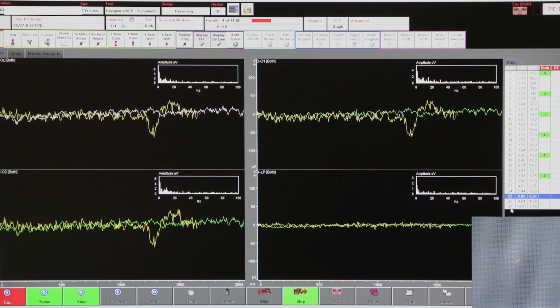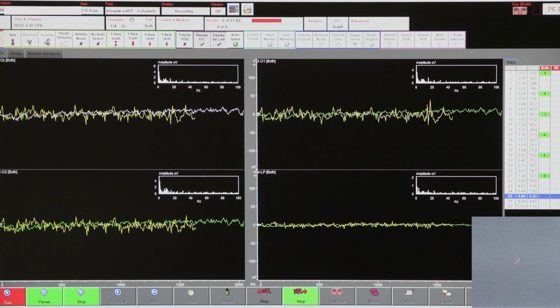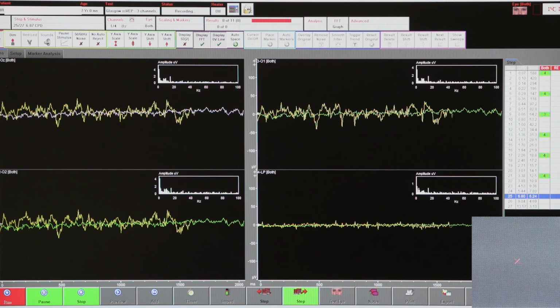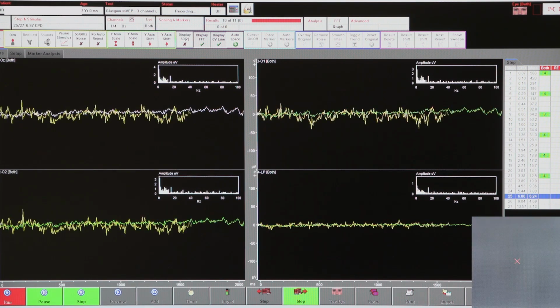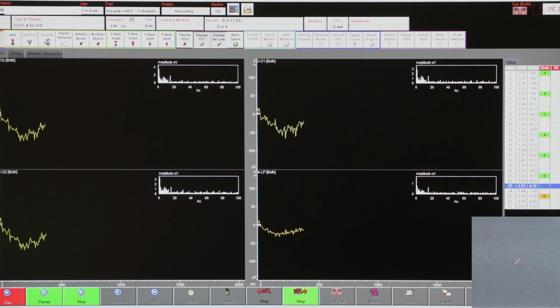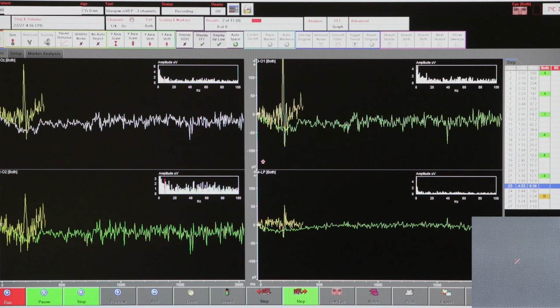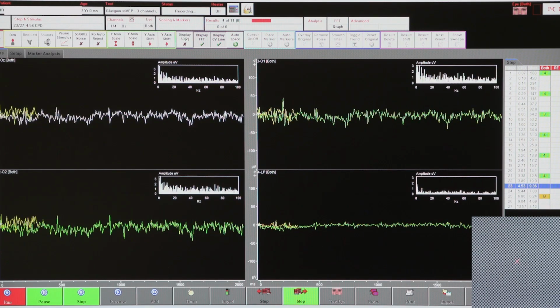And for each check size, we have a maximum of 11 epochs before the algorithm will give up and assume that no VEP is present. This is a configurable option, and it depends on the choice of epoch duration. Here, we're demonstrating epochs which are 2 seconds in duration and use a maximum of 11 epochs per check size.